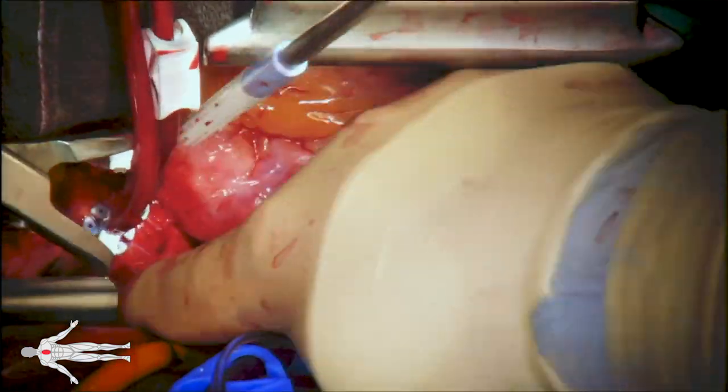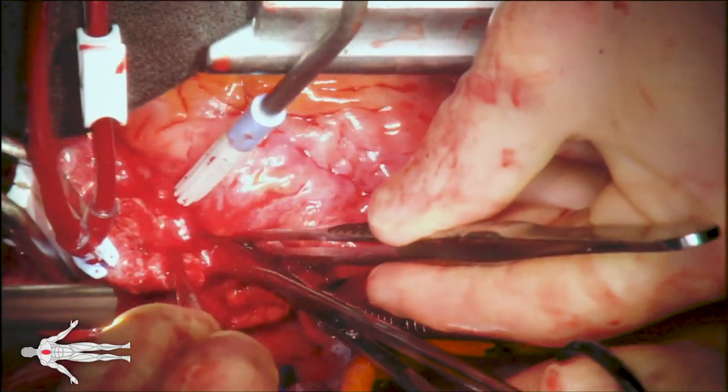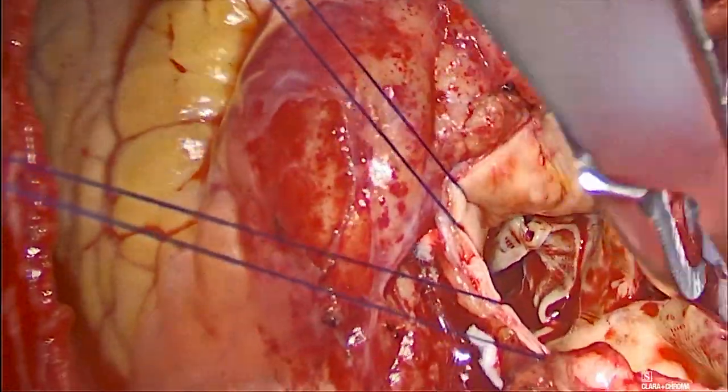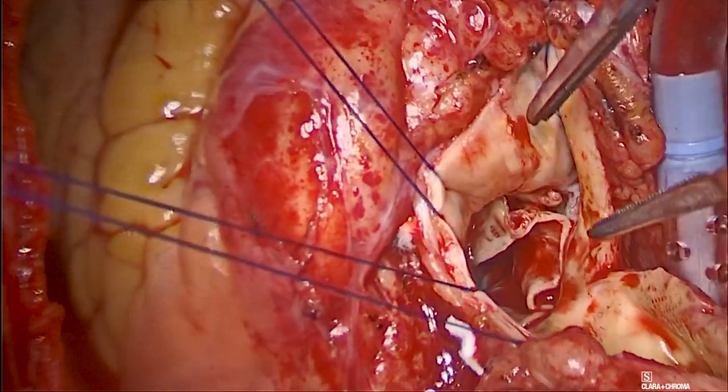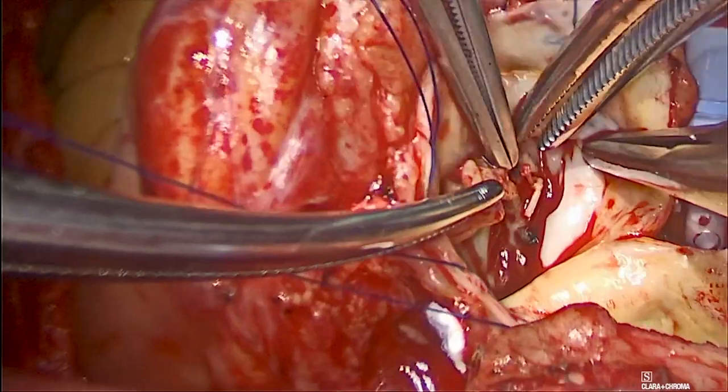A cross-clamp was applied and the heart was arrested in a retrograde fashion. Aortotomy was performed and the aortic valve was exposed and inspected.